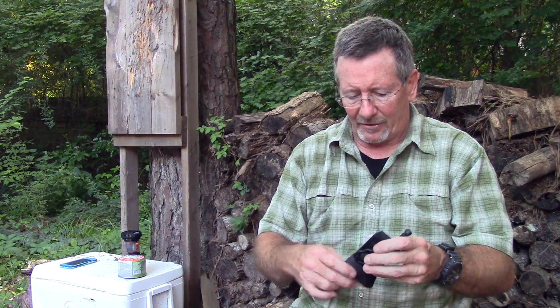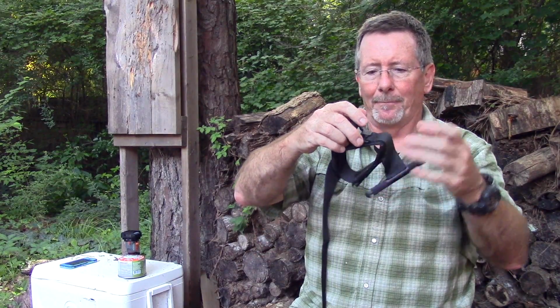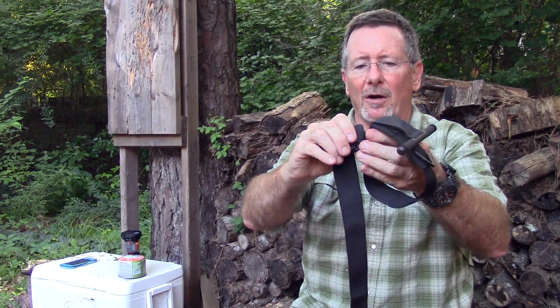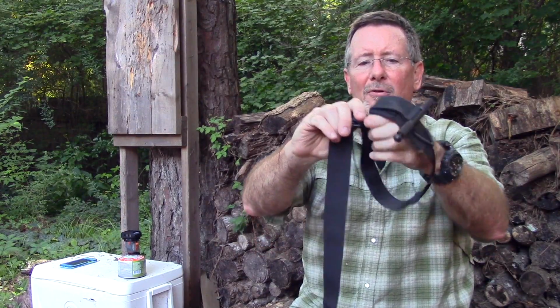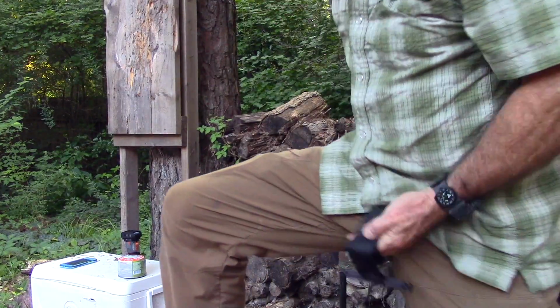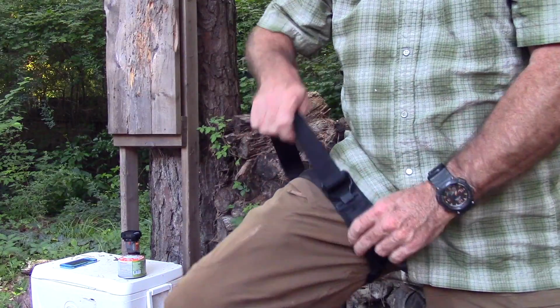Next one we'll take a look at is the SOFTT-W, and this is a windlass style tourniquet, and it's a little easier to put on by yourself. And this is a new improvement. It's got a latch system here for taking it off or on. If you want to put it around your leg really quickly, you can just pop this. It's got a little buckle here with a little loop. You can put it around your leg or your arm and just hook it on. If you can't slip it over, it's really easy to snap on like so.